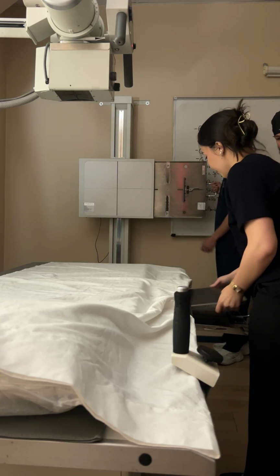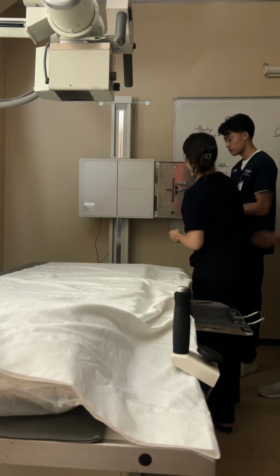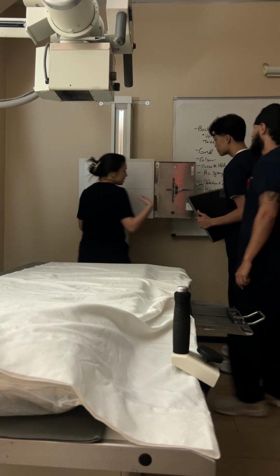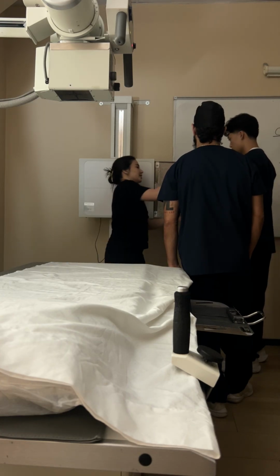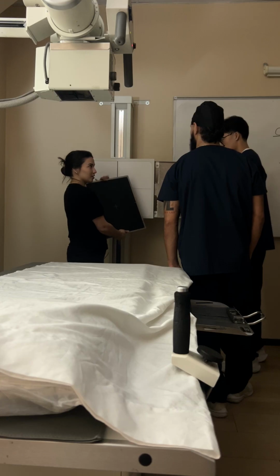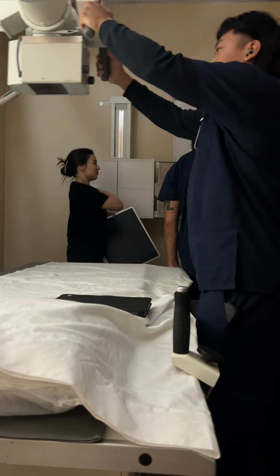And one distinction about this x-ray tube is that your setting of your x-ray tube will only be accurate if that table is at the maximum height. Okay, so keep that in mind for your positioning. Yeah, it needs to be up as high as it can go.